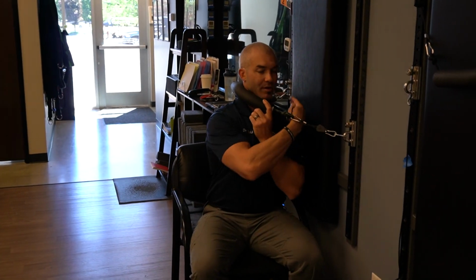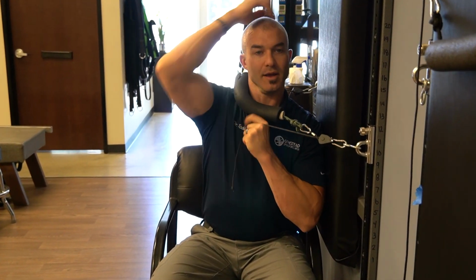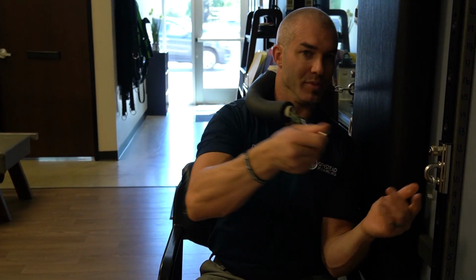These cinch up. There'd be a block here in between at the head to keep this neutral, because if I just pulled like this, I would bend my head over like so. So there'd be a block right here, and then we would control the force as far as how this is shifted over. The patient would hang out in here, we'd set a timer, and they would do this for 15 to 20 minutes. But they would not just jump into traction like this cold, okay? It wouldn't be adjust them and then send them over to traction.